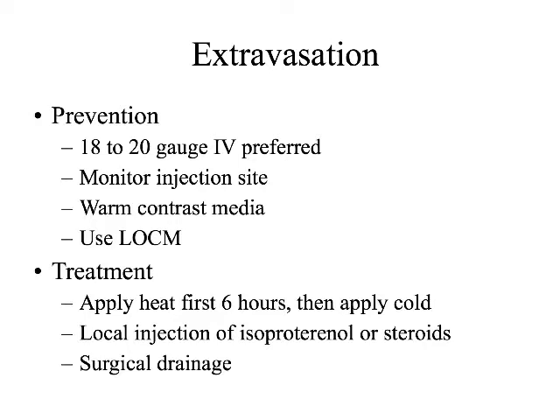We want to monitor it. We want to watch things. We want to warm the contrast media, because we said that can do what? Yes, reduce viscosity. So that would help with extravasation as well. And just using the low osmolality contrast media will also prevent extravasation.